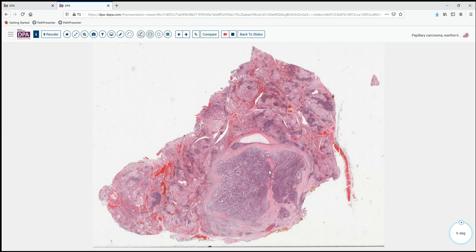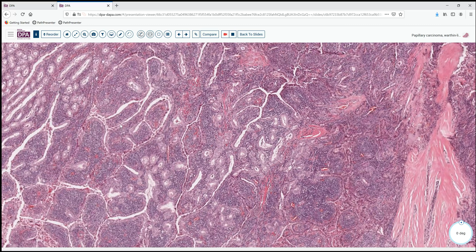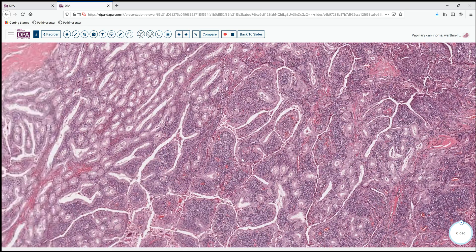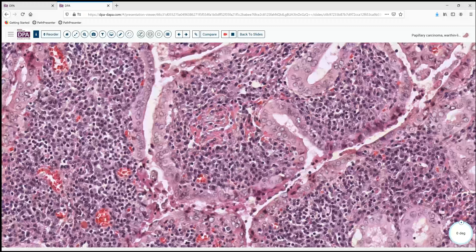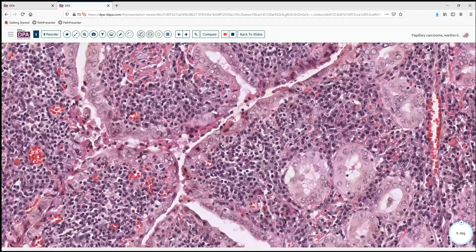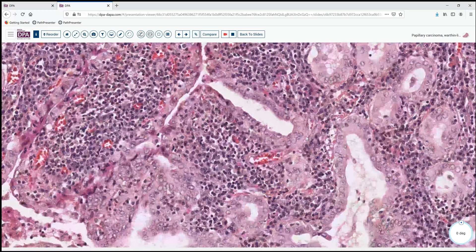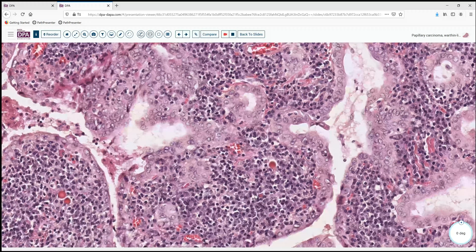I mentioned the other variant, the Warthin-like variant, and here's a nice representation of that lesion. You can see the very evident lymphoid stroma right off the bat. You might wonder, is this an adenolymphoma or lymphoepithelial lesion? But lo and behold, on high magnification we have fairly tall columnar cells, certainly a fair amount of cytoplasm, and we've got nuclear features of papillary carcinoma. So when we see lymphoid stroma and these slightly enlarged cells, we would call this the Warthin-like variant of papillary carcinoma, not tall cell carcinoma. The stroma is all lymphoplasmacytic cells, which excludes it.